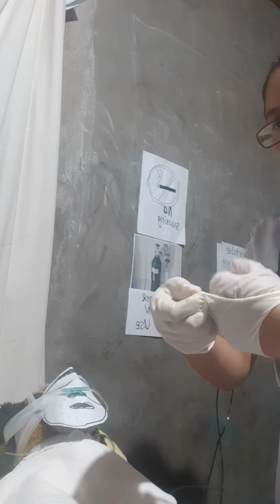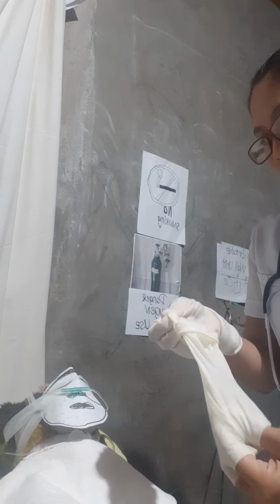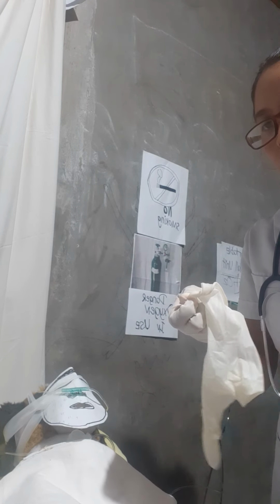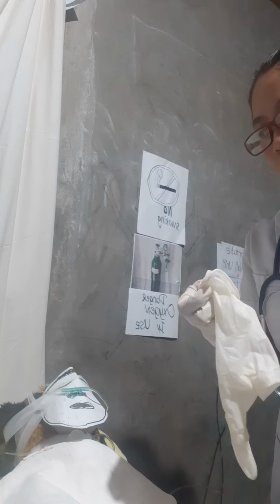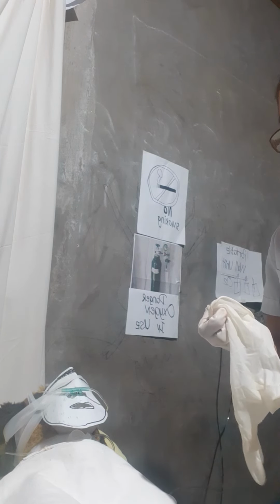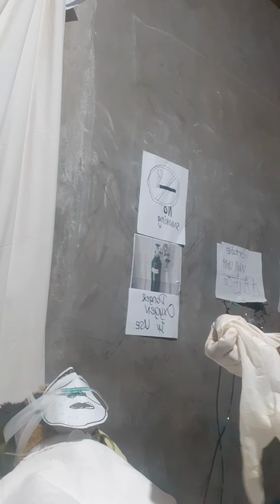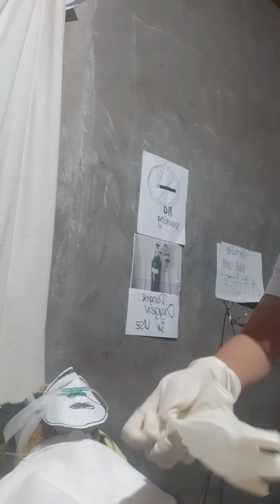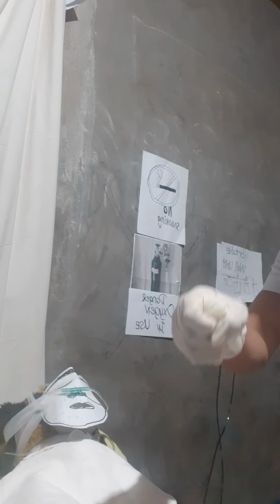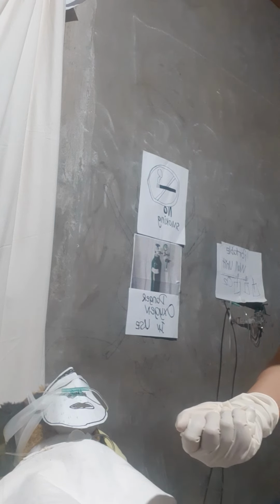The catheter should be inside like that, so that if there's secretion, nothing is pulled or peeled or spread, to avoid any contamination. And we need to put it in this way so that it will not spread also.